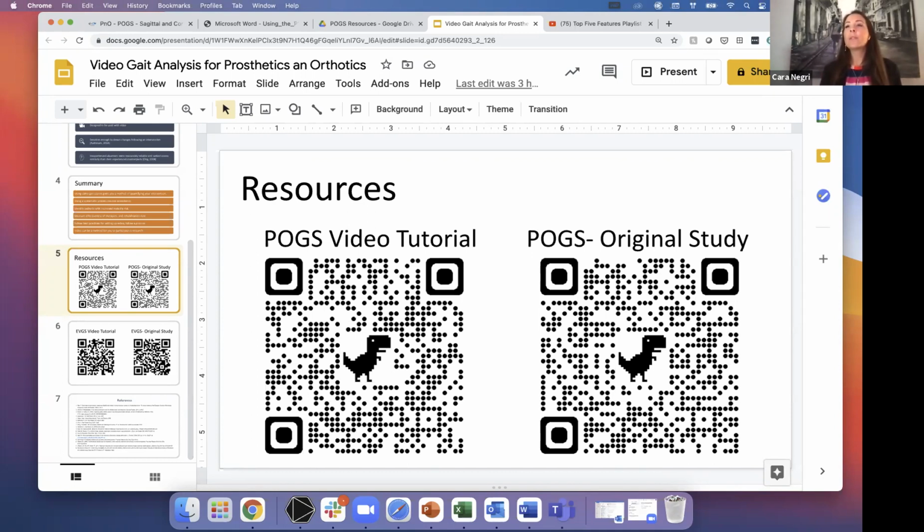But what I'll do is when they come to me and say that they think they're ready to have that patient leave with the delivery of that prosthesis, or have a patient take a diagnostic socket home, I'll have them take a video before I give them my feedback on their alignment, so that they can go back and look at the video. Because sometimes when they're in the room doing dynamic alignment for a long period of time, they just get to a point where they might stop seeing what's going on in its entirety.